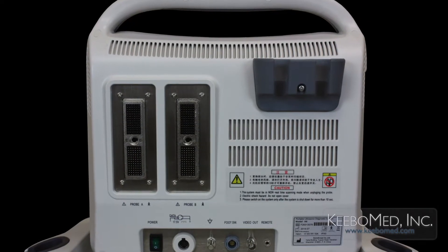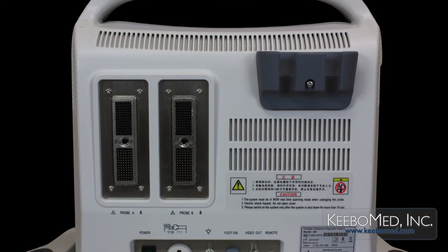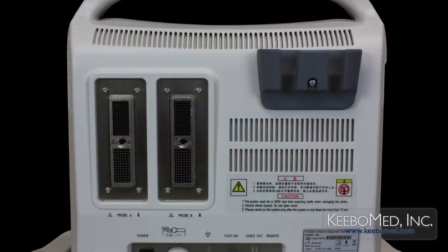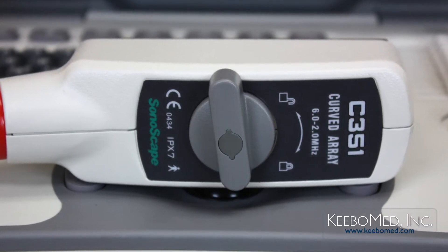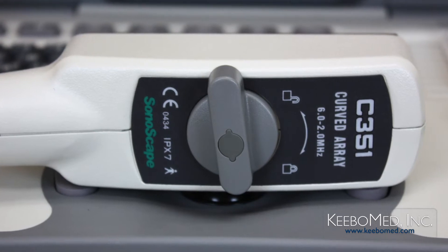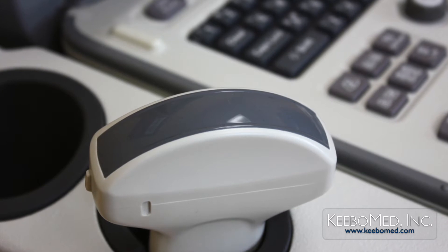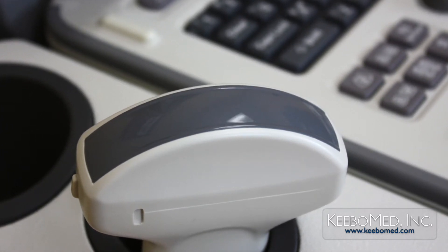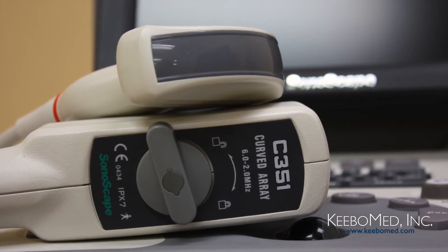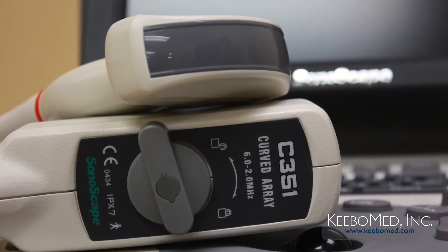On the back of the A6 ultrasound are two transducer ports. Learn how to properly connect the probes to the A6 in this video. The A6 supports a variety of different probes. Use only the probes provided by Sonoscape for the A6. Probes can be connected while the system is powered off or powered on. The following demonstration shows how to connect the probe while the system is turned on.